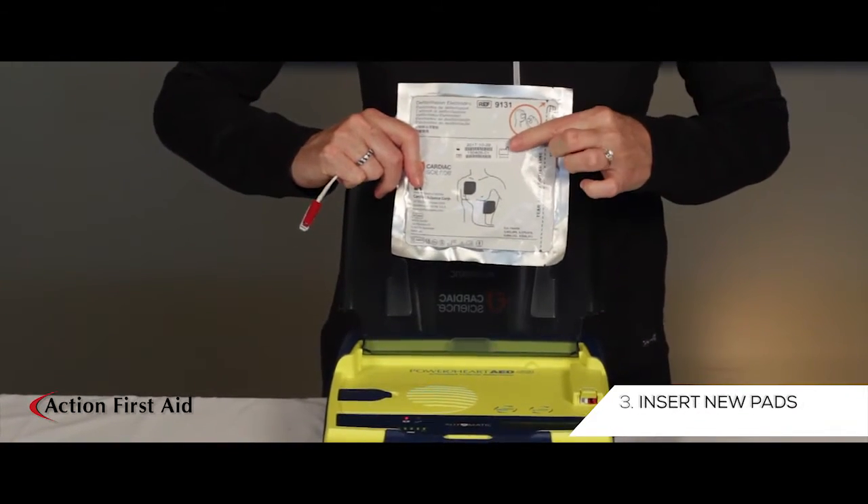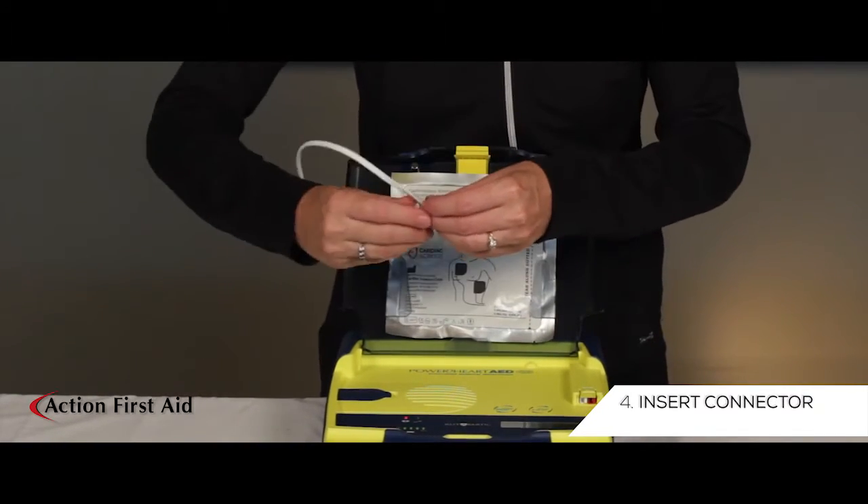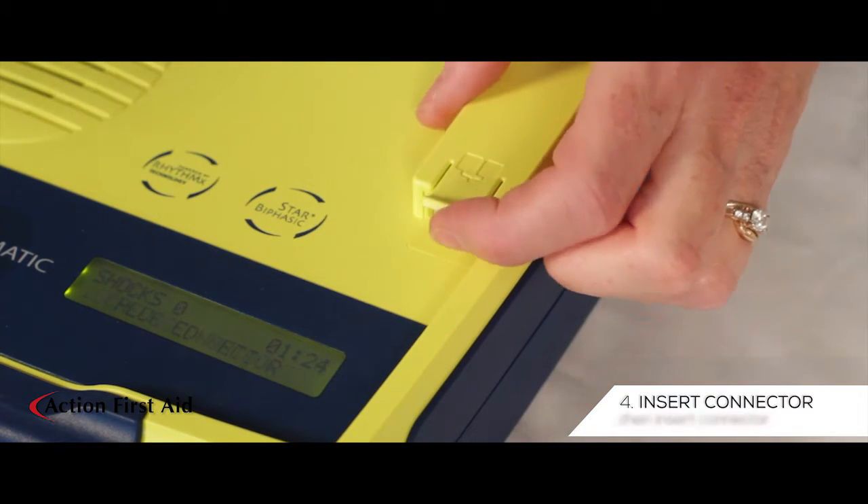Insert the new pads into the lid of the AED and insert the connector. Remember to lift the yellow tab to insert the connector.